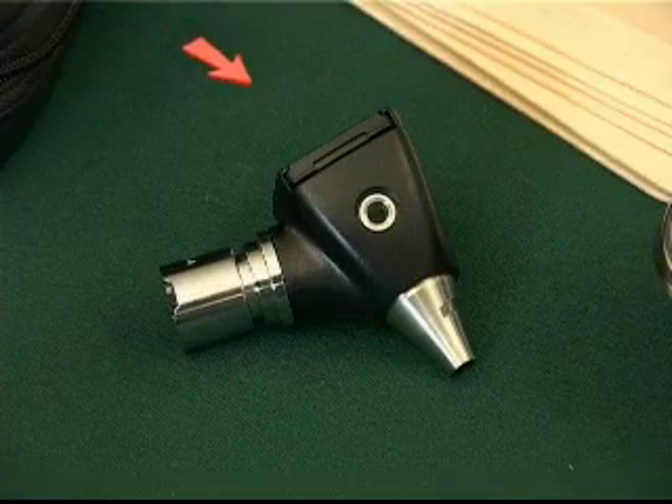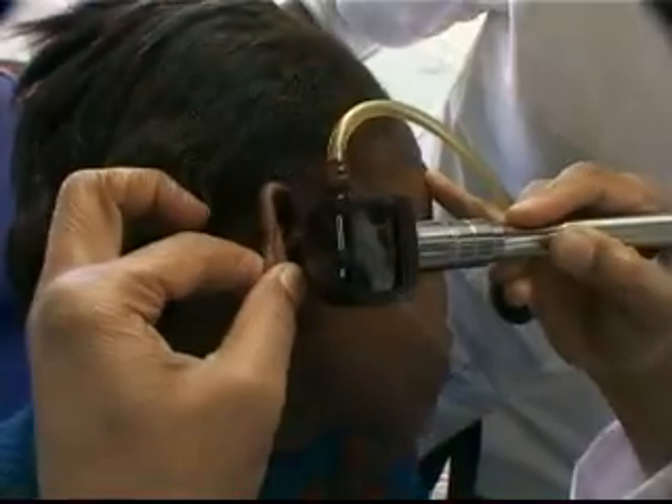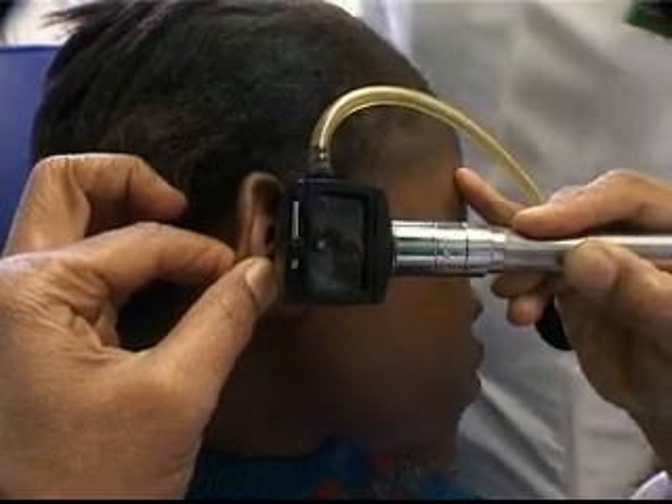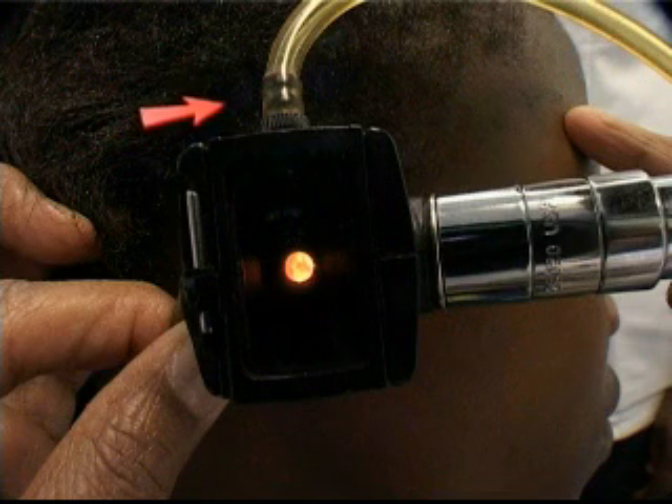On certain types of otoscopes, there is a small hole on one side — this is the insufflation port. A small insufflation bulb is attached to this port and air is introduced into the ear to facilitate certain ear examinations.